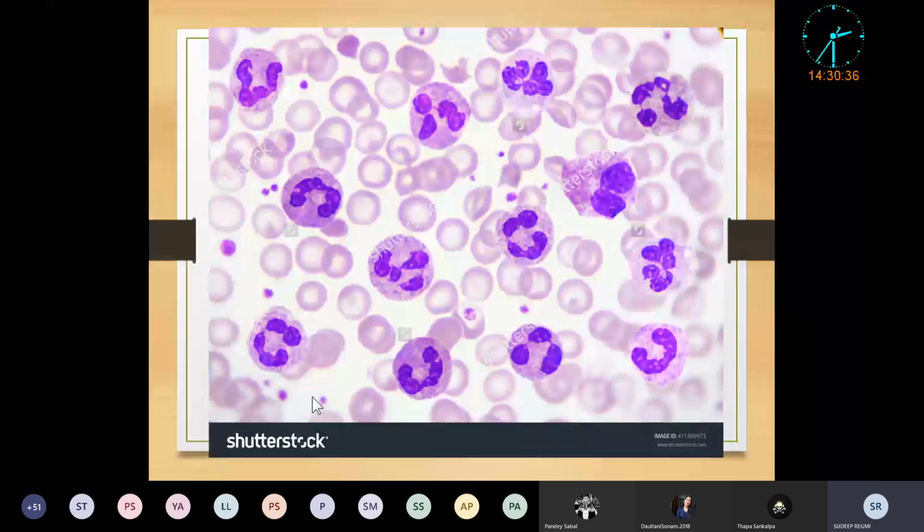You see the RBCs, which look normocytic normochromic. The total WBC count is increased with neutrophilia, and platelets look normal in count. There are no hemoparasites seen in this field. So it is neutrophilic leukocytosis. Can anyone tell why these are neutrophils?